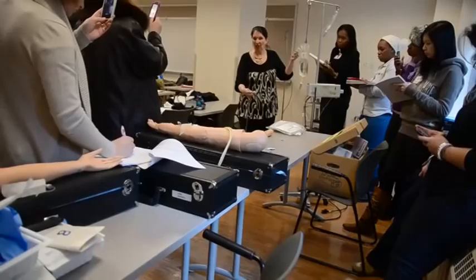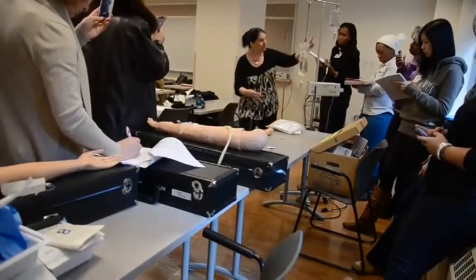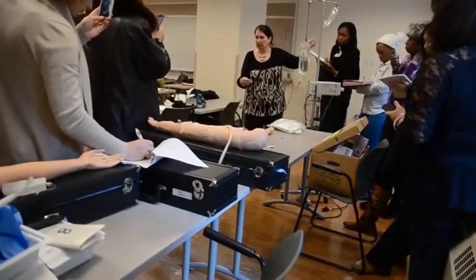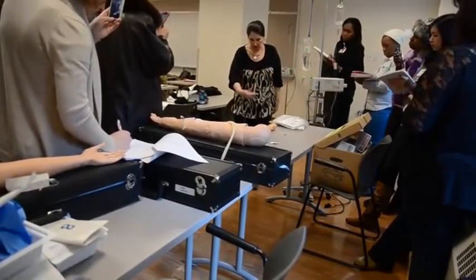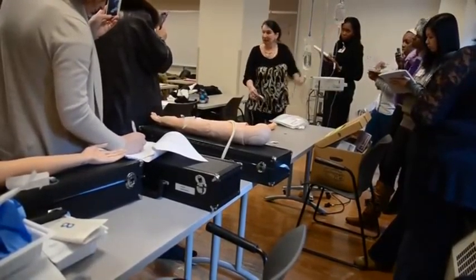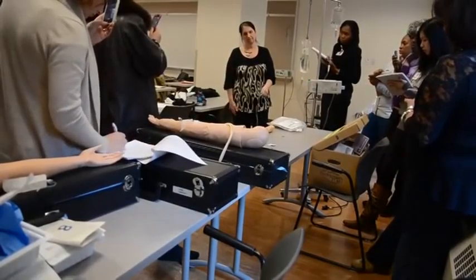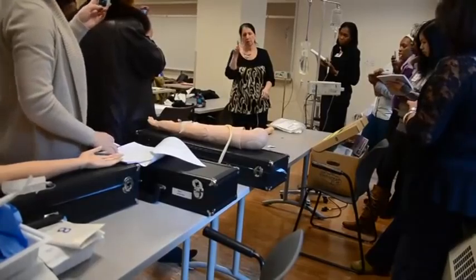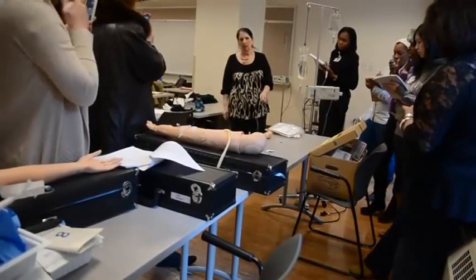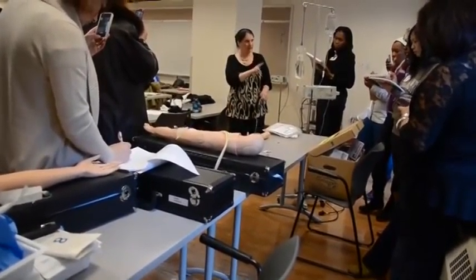Now how do you control it is the key. You see this clamp here and this clamp here? This one has to be completely open. The one on the secondary line to the antibiotic — wide open. You're going to control it from the one closer to the patient. That's how we regulate it. Because then when this is done, this will stop, this one will start automatically on its own when this is empty, and then you have to come and switch it.